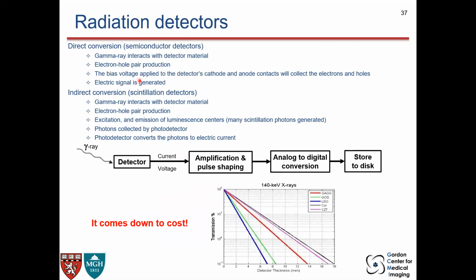So remember from a few lectures ago, maybe Lisa talked about this, or Moses talked about this 2 lectures ago, that direct conversion makes it easier to handle the radiation detector signal when we have a semiconductor detector. There is no intermediate layer of photodetector.